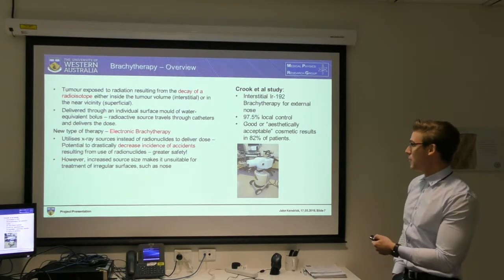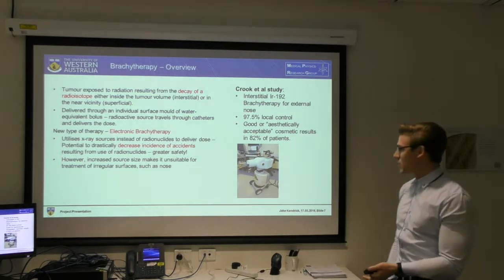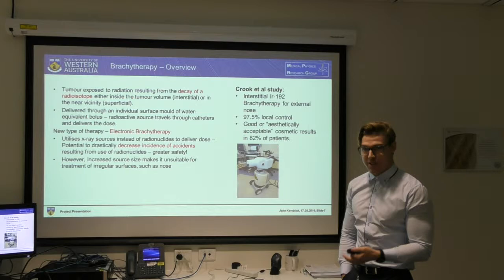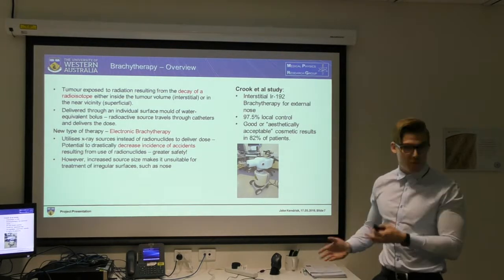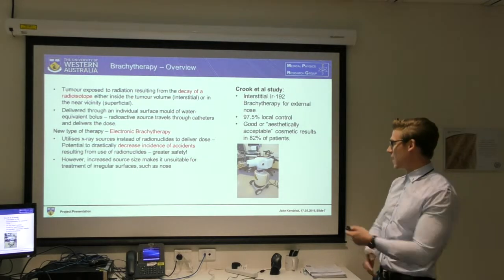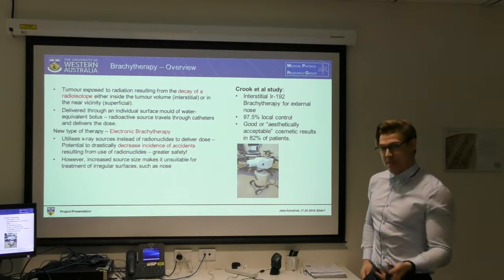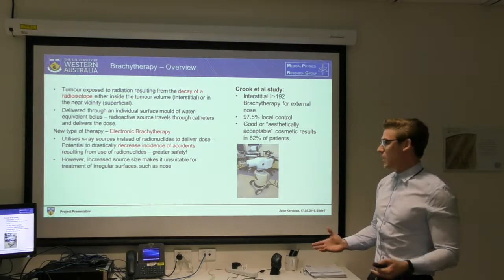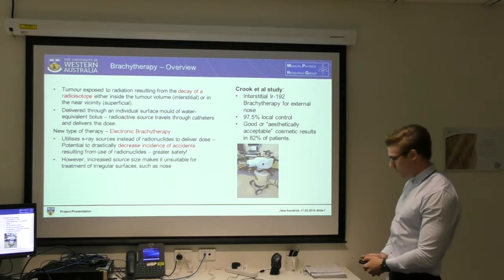There is a new type of brachytherapy called electronic brachytherapy, which utilises small X-ray sources rather than radionuclides, which has potential to reduce a lot of accidents that occur from transportation and setting it up in the clinic, so a greater safety outcome. But at the present moment, the source size is too large for it to be suitable for treating skin cancers of the nose, so it's not used at the moment.